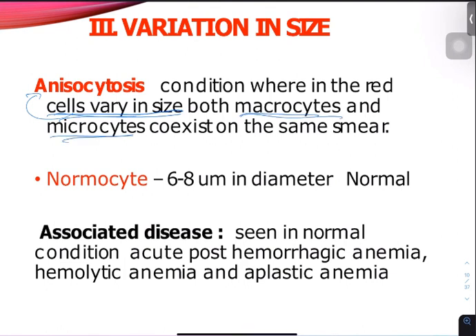Kanina binanggit ko na din, what is your normal RBC size? It's 6 to 8 micrometer. Less than 6 micrometer, it's your microcytes. Greater than 8, macro.